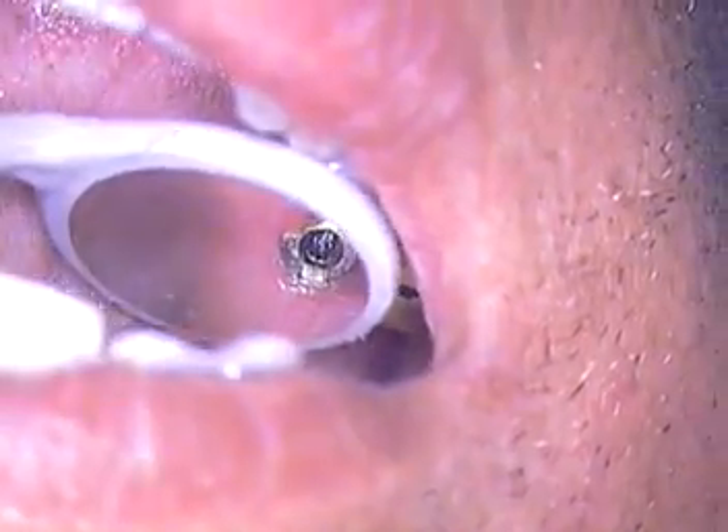Use a microscope — that's the beauty of that. There it comes. Now we have a larger suction tip on our micro suction. We went with the color code — pink — so it's from Ultradent, and that pink product is large enough to get this.